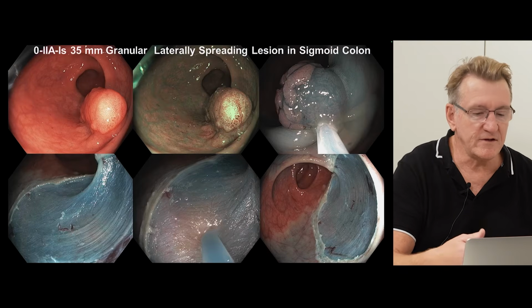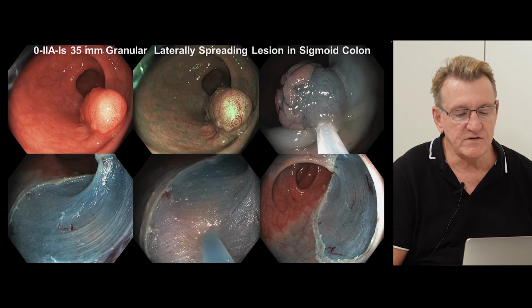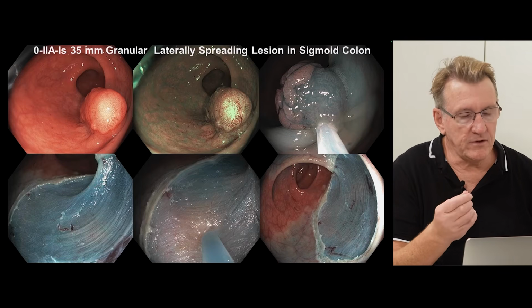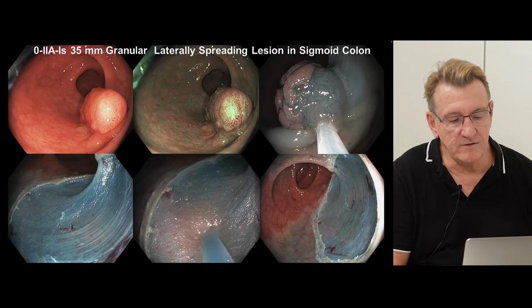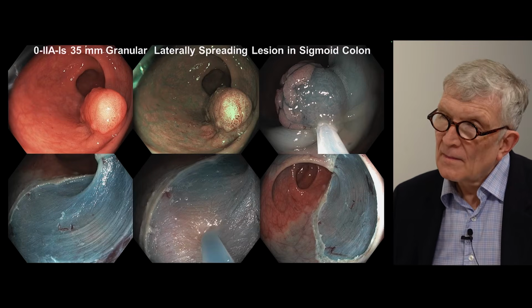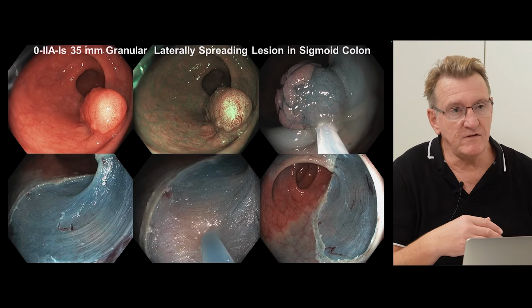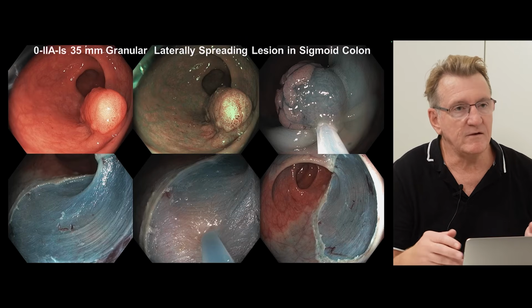Well, if you see that, it's a point of interest, because there will be a thin layer of submucosal tissue overlying it. So it's a point of interest to actually do this technique we call TSC, topical submucosal chromoendoscopy. So with the needle retracted, you just irrigate blue dye over that surface, indigo carmine, and you can see in the final image that the areolar tissue, the submucosa, is avid for the dye, and you get this uniform staining. So we showed in a paper that we published 10 years ago in 2014 that when we did this interrogating defects, we were able to identify small perforations that we hadn't previously seen and close them and eliminate the problem.